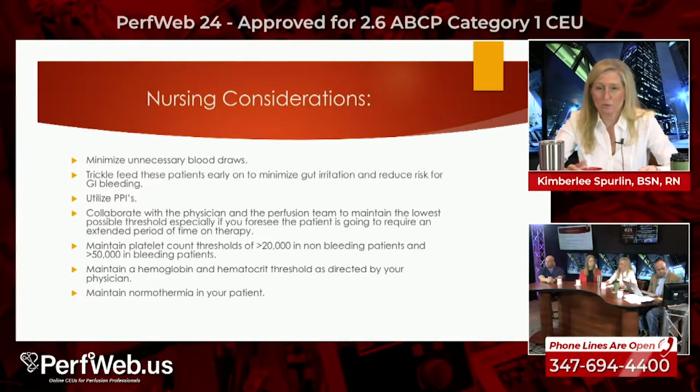Always, it seems like a simple thing, but maintaining normothermia in your patient, whether you have a Foley temp sensing probe or you put a rectal probe in these patients. A lot of times temperature is one of those things that people just don't think about. These aren't patients that you're monitoring every 4 hours and watching fluctuations. No, you're watching them every hour and using your heater cooler to maintain your patient temp. It seems like a very simple thing, but normothermic patients don't bleed as bad as cold patients bleed. Right. Cold blood don't clot. Exactly.